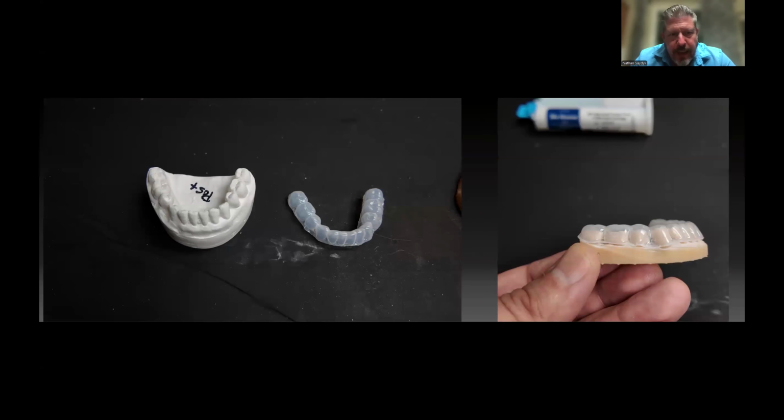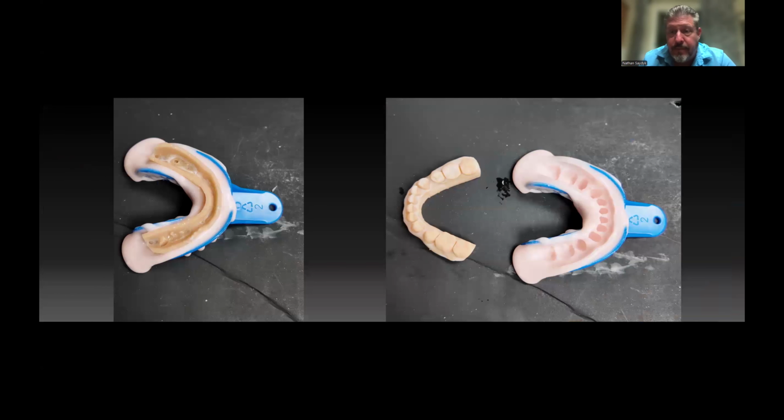So here's my wax up, and I made a matrix. I want you to imagine that this tan piece here is the patient, and I've prepared their teeth. You can see old filling material is missing here, and there's a space where I wanted to build these teeth up, make them taller, because they wore them away. When I try on my matrix over, I can see there's space available, right? So this is the patient's mouth.